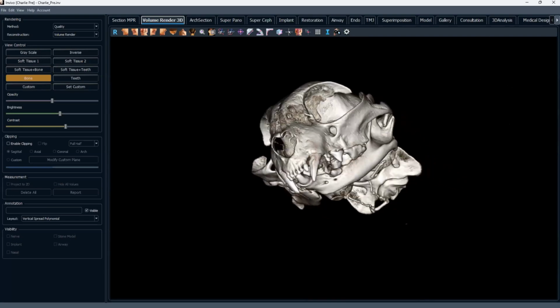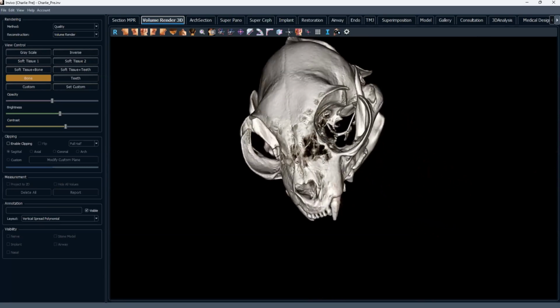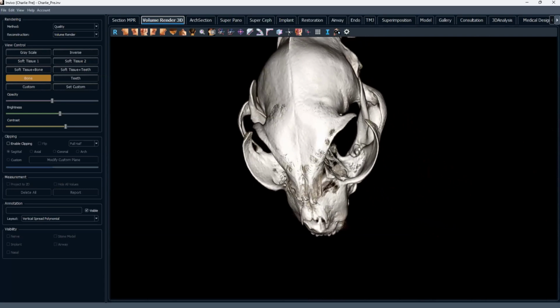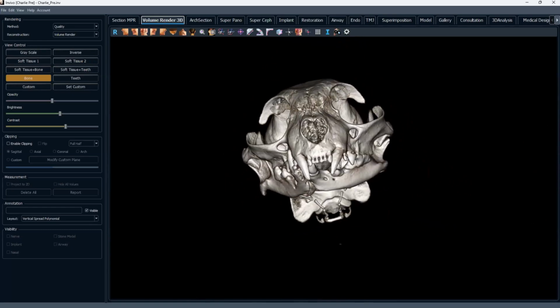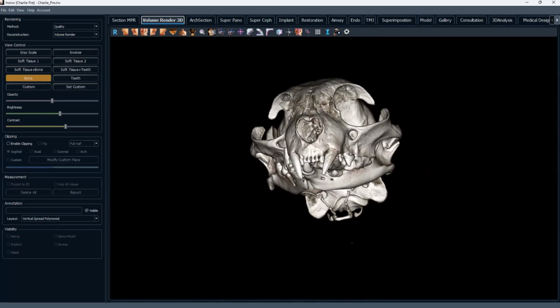And then we're also looking at him to try to figure out where this bleeding was coming from. If we look down through the orbit, he does have a little bit of a defect in the bone of the caudal maxilla where this left molar sits. You see it's asymmetrical. It's normal here on the right side, but there is some bone loss here. We couldn't really see that because we couldn't get his mouth open, but there was some concern that he had a soft tissue defect there as well and may have eroded into the palatal artery or something like that, and that's where the bleeding was coming from.